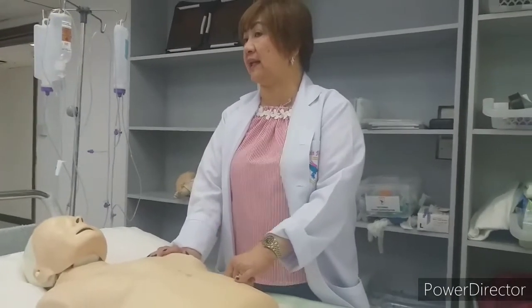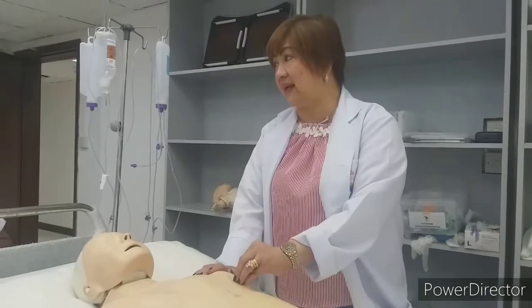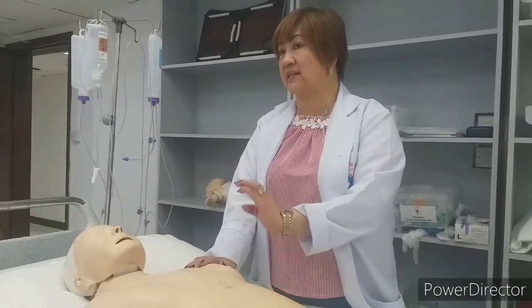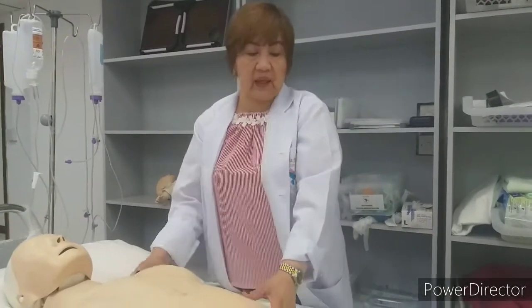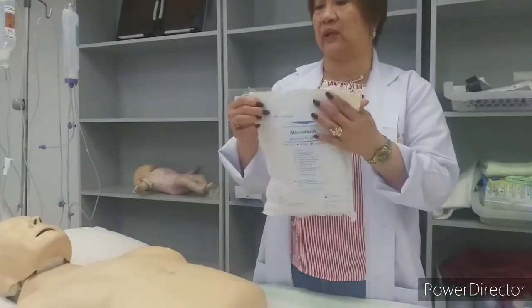So number one is to provide good wound healing. Second is to definitely prevent further infection. Next is to provide patient comfort, because once the wound is clean, they will be feeling comfortable. Now, what equipment do we need to use?